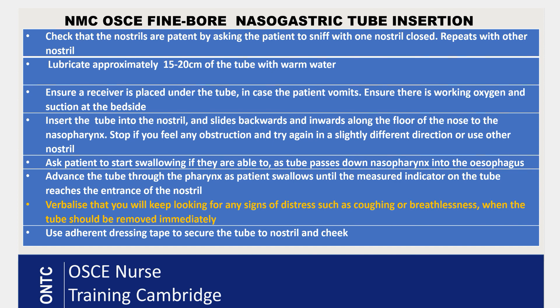Insert the tube into the chosen nostril and slide it backwards and inwards along the floor of the nose toward the nasopharynx. If you feel any obstruction, stop and try in a slightly different direction or use the other nostril — verbalize this. Once you reach the nasopharynx, ask the patient to do dry swallows as the tube passes down into the oesophagus.